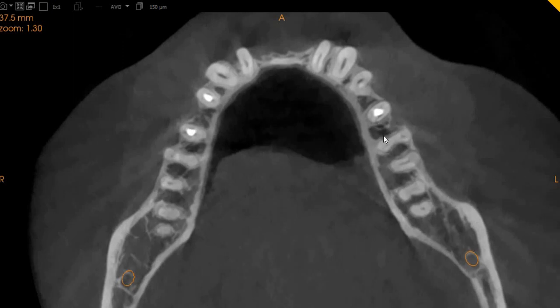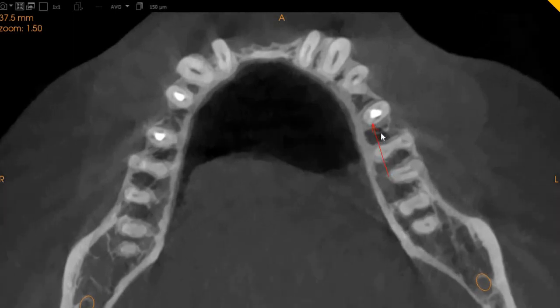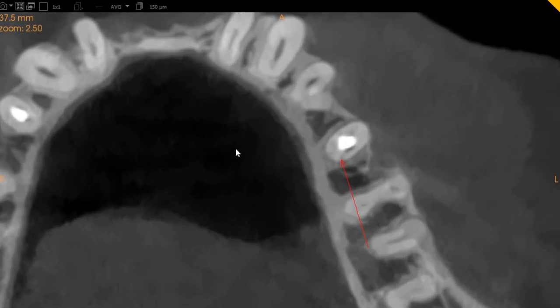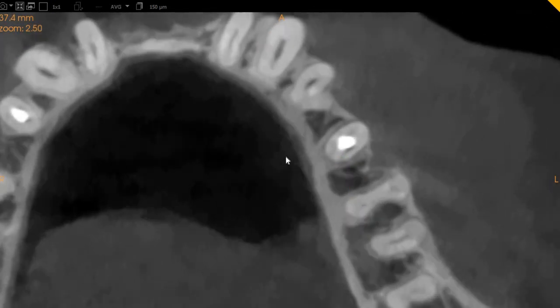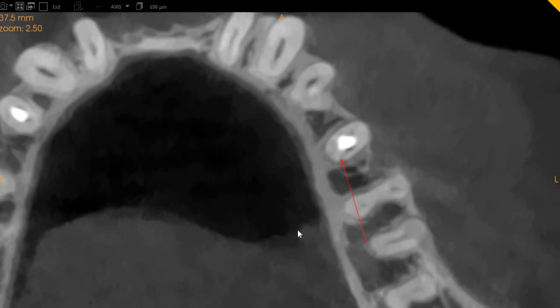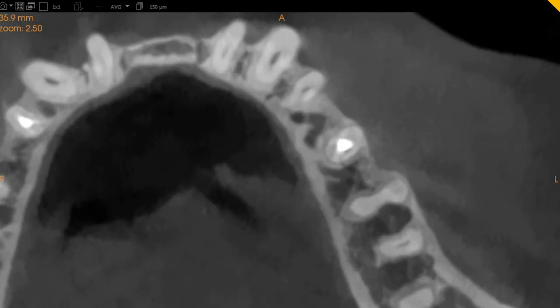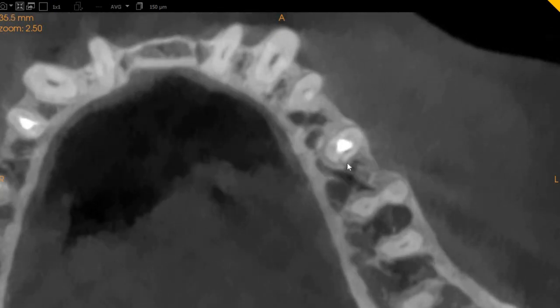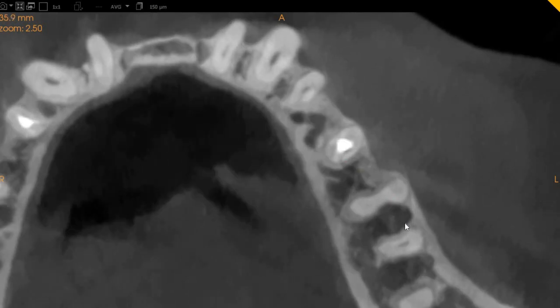Moving on to the axial portion, you can see this is the same line we were discussing. I'm going to zoom in for the doctor — there is definitely a line here extending in the distal aspect. This also leads to a slight radiolucency or PDL widening on the distal. As we move further down, this line continues to be present. Because of the aggressive nature of the endodontic treatment, this tooth may have a vertical tooth fracture.